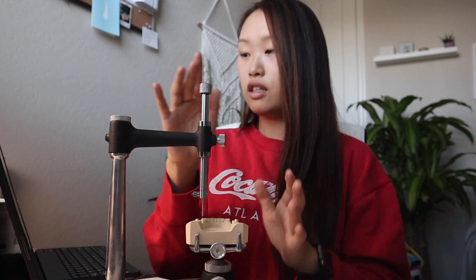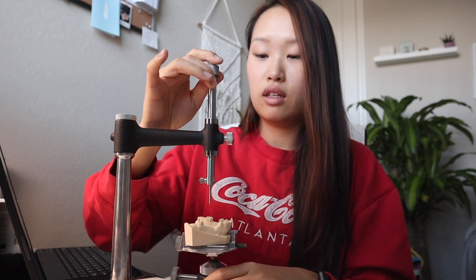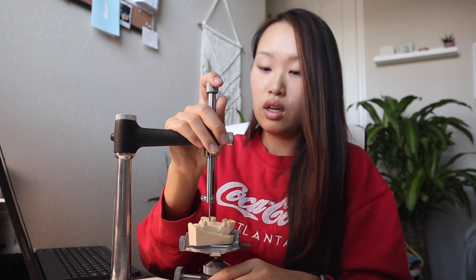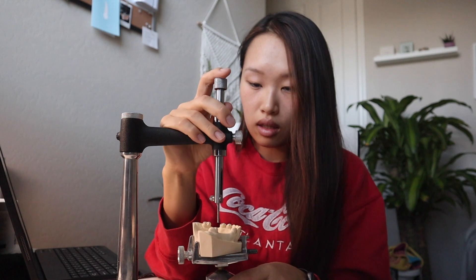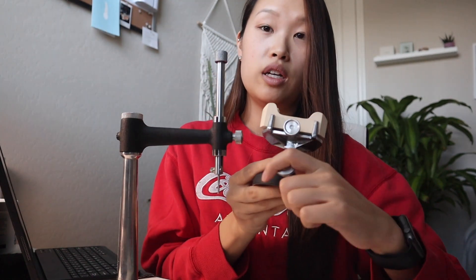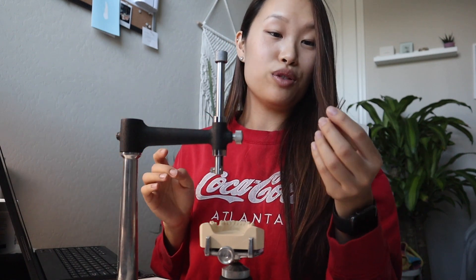Okay, so first things first — this device right here is the surveyor. I'm just using my manual because I want to make sure I'm doing everything right. This analyzing rod actually moves up and down so you can basically align it with the different surfaces of the tooth. First off I'm going to place this rod at the proximal surfaces of the abutment teeth to make sure that everything is parallel. If I need to make any changes I would use this screw and level it accordingly. In here we actually have different tips, and I just realized I was using the undercut one and not the analyzing rod, which looks like this.